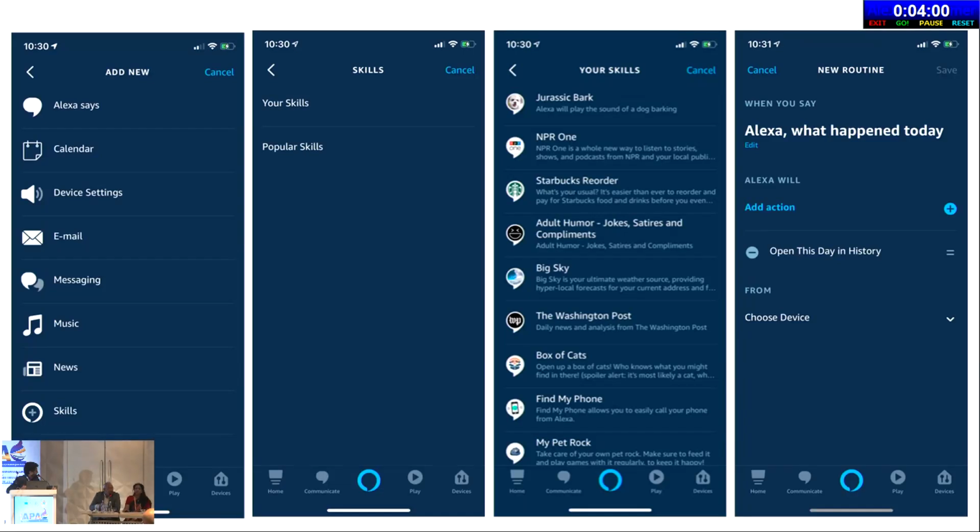So do you operate without an assistant nowadays? Only the nursing staff will be there, sir. No other person will be there in the OT. Okay, you mean you don't need an OT assistant. Yeah, I wouldn't have an OT assistant, sir. Okay, perfect. I think it's a wonderful way.